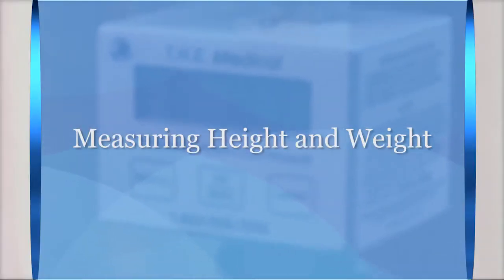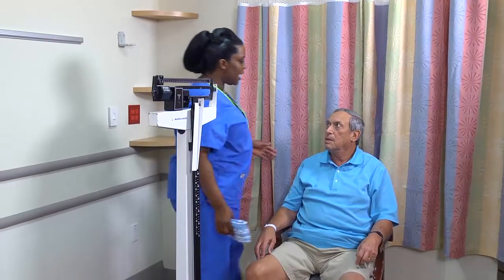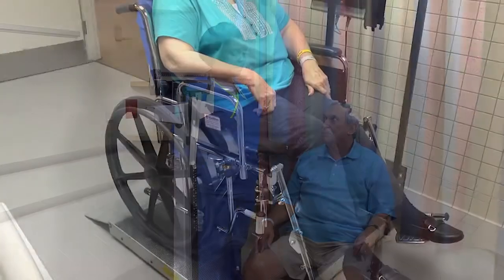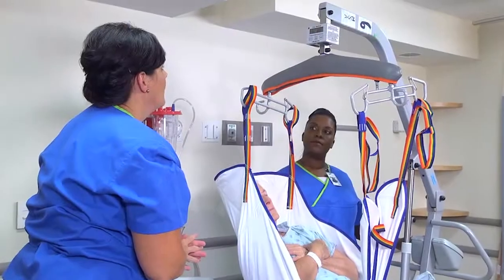To measure a patient's height and weight, first determine if he can bear his own weight and stand safely on a scale. Mr. Gold, I need to get your height and weight, okay? Are you able to stand on your own? Yes. If the patient is unable to stand, use a wheelchair or bed scale to weigh the patient.